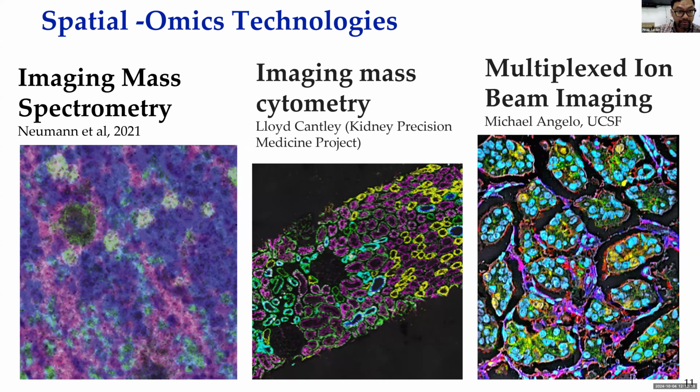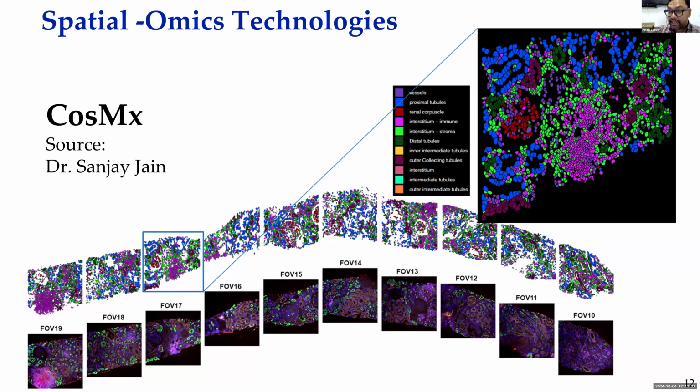the metabolomics information. At UF we have a leader in this area, Dr. Ramon San. He is spearheading this area. Then imaging mass cytometry, which is another way of measuring different cell types. Then multiplex ion beam imaging, and CosMx. It basically targets hundreds of transcripts, but in a special way. This is another new area, maybe with higher precision than other previous methods.